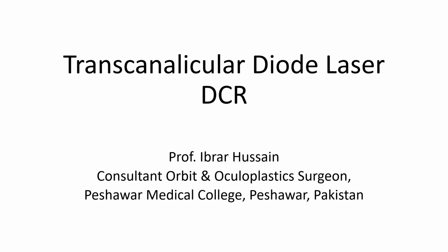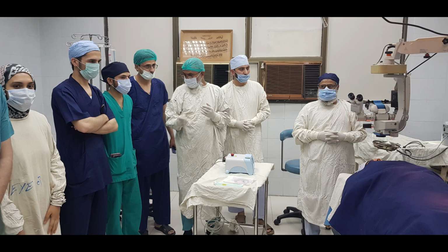Today I'm going to share with you the latest surgery for chronic dacryocystitis, that is Transcanalicular Diode Laser Dacryocystorhinostomy or DCR. In this procedure, a thin diode laser probe is passed through the canaliculus into the lacrimal sac, and a communication is made between the lacrimal sac and middle meatus using thermal energy of diode laser. Here is our team with diode laser machine on the table.